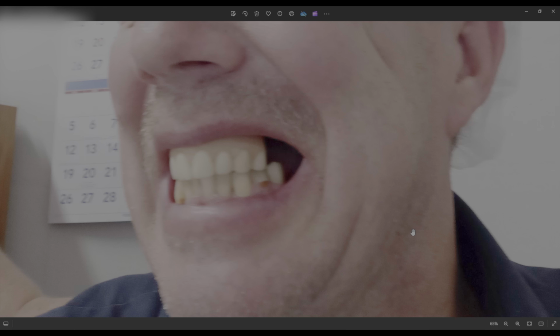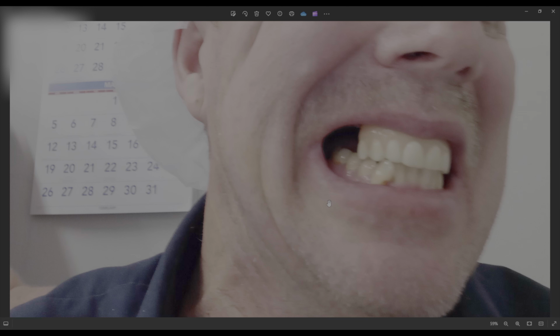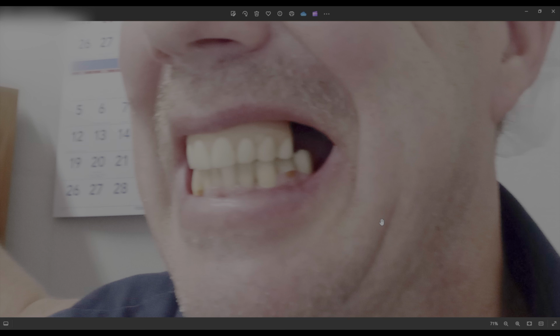All right, so we want to show you a special case that a patient sent us from Florida. This patient had spent over $20,000 for an all-on-four, and he was wondering why he was looking like this. And this is the view from the other side. Yeah, so obviously looking at this, he has no back teeth, right? So anybody that invests a lot of money is probably not going to be too happy about that, right?